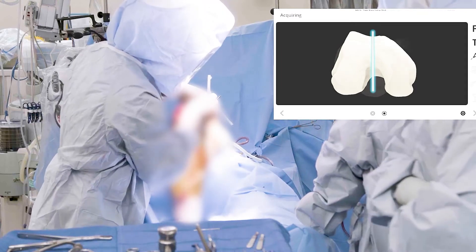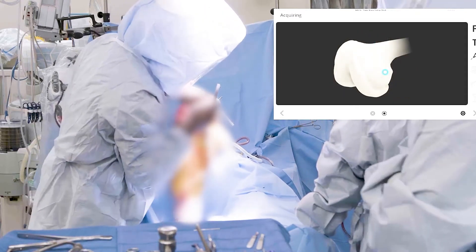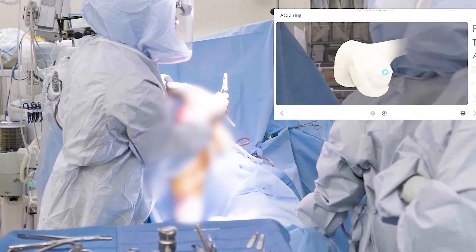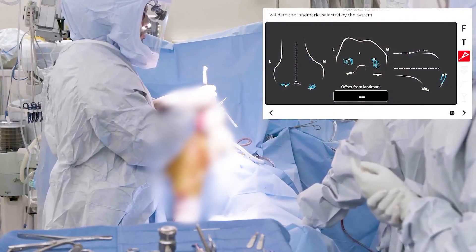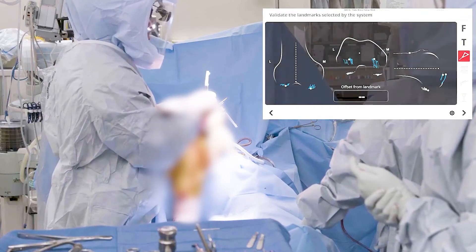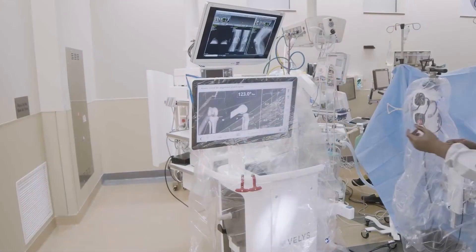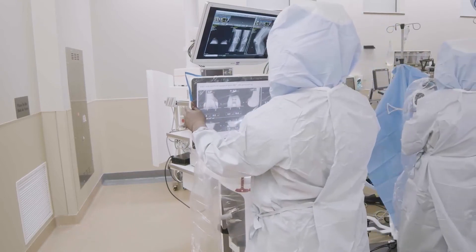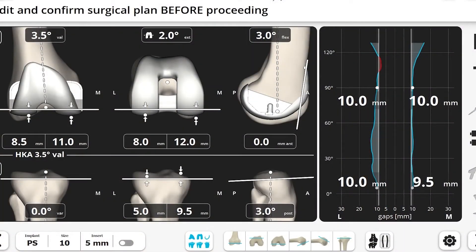Once the assessment is completed, the robotic system will generate a three-dimensional model of the patient's knee and allow your surgeon to precisely position the implant to ensure adequate stability of your knee throughout the range of motion. This will help allow your surgeon to ultimately place the final implants in a position that will allow for full restoration of function.